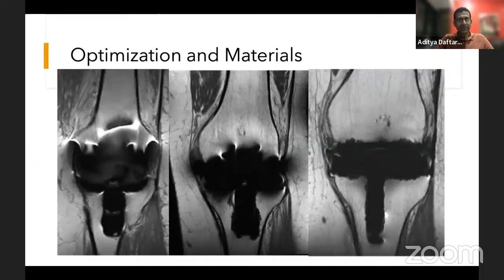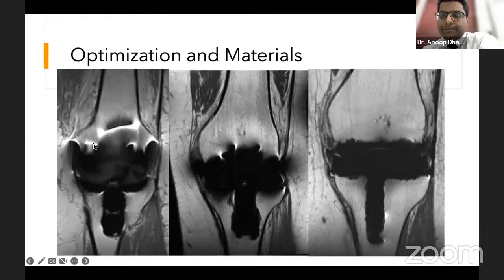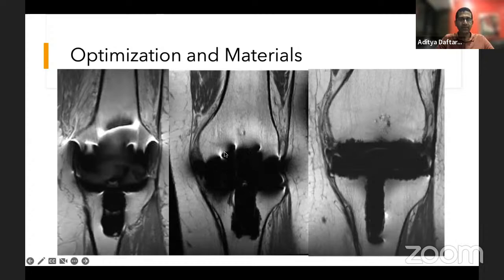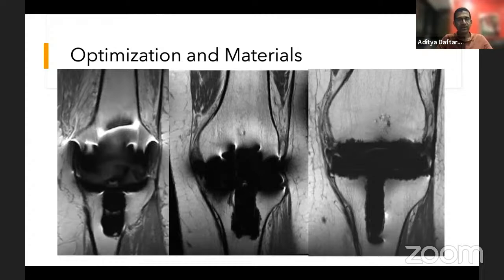Here are three MRI scans showing the difference that protocols make. One patient without metal artifact reduction protocols shows significant artifact from a titanium-type implant. When metal artifact suppression protocols are used, there is much less streak artifact and much better definition. A third patient with an oxidium or zirconium implant shows almost completely absent artifact. This illustrates how images look different based on these parameters.